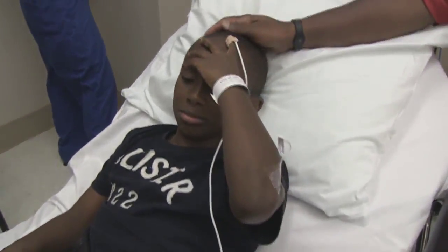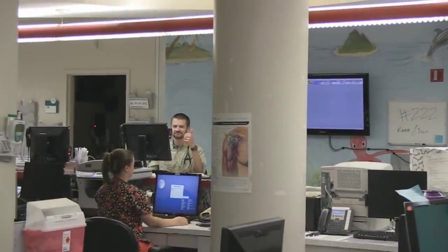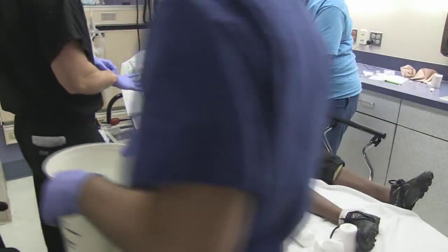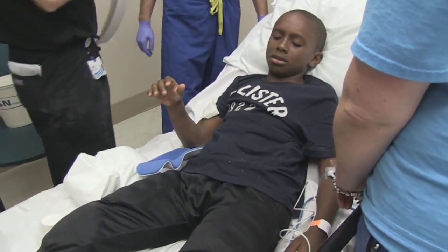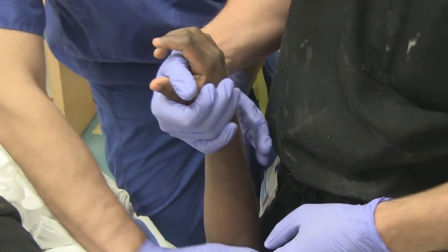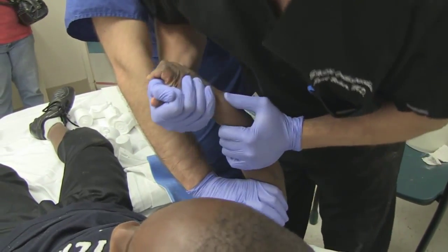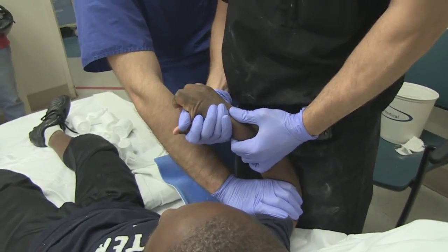How'd you do? Luke, are we getting the morphine? You should be feeling good now. You can have an assistant — that's what he can do. All right, let's go. You're gonna do just fine, buddy. You're done. You're doing great.